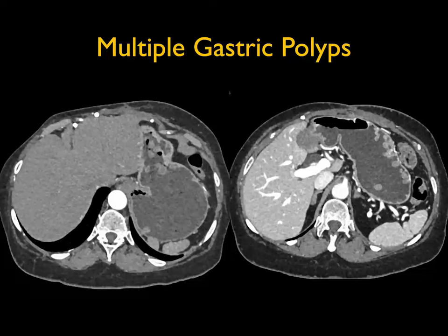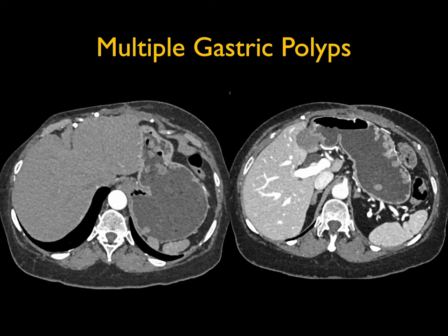Case number one shows multiple gastric polyps. We talk a lot about polyposis and the importance of technique. You need to distend the stomach with 750 cc's of water. I like water better than positive contrast, particularly when looking for subtle masses in the stomach. You also want to use IV contrast. Polyps can be seen in the stomach as incidental findings, but when you see multiple polyps, you think of polyposis syndrome, whether it's FAP or Gardner's or something else.